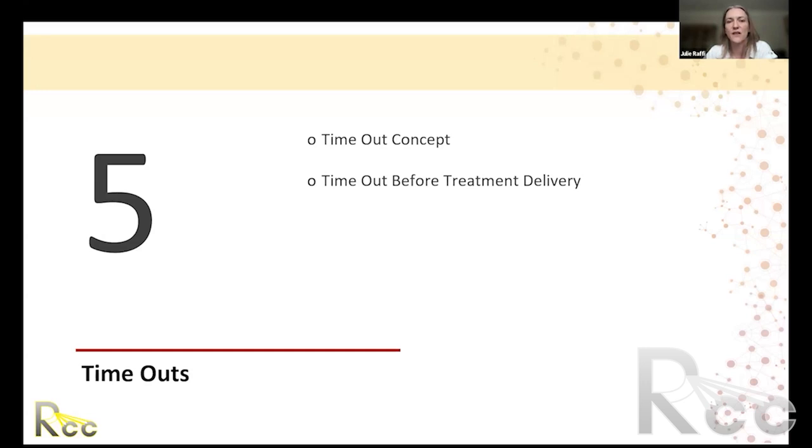But if it's using the automated system with your treatment machine, that's generally going to be moving the treatment couch to get to the right position. That might only give you limited options for what you can shift. So probably left, right, up and down, in and out, maybe rotation if you're allowing rotation shifts. But if you have to actually change the positioning of the patient's arm or their chin, then you would move the patient themselves.